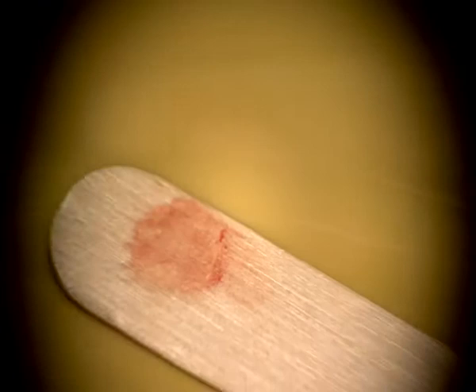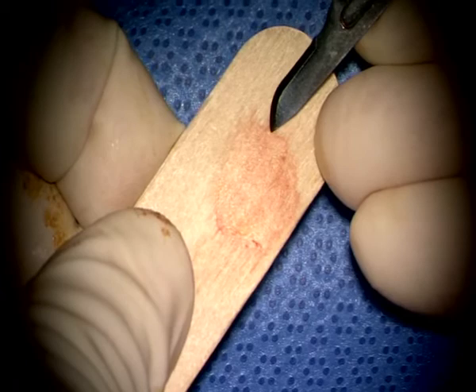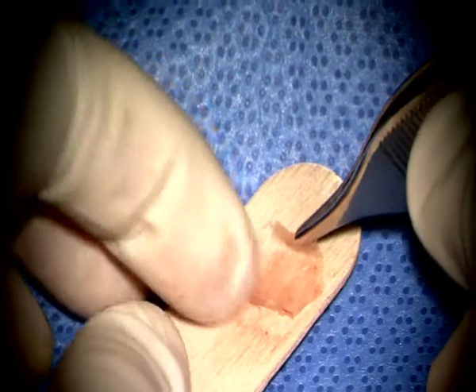and prepare the graft. So you can see the graft is pretty thin, exactly like we like it. Take this. Give me the knife. Just elevating it off. Add some, please. So what I find useful is to try to get a kink for the inferior gutter.